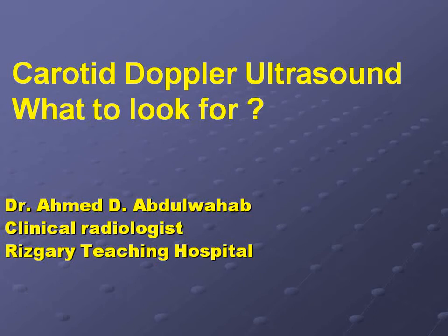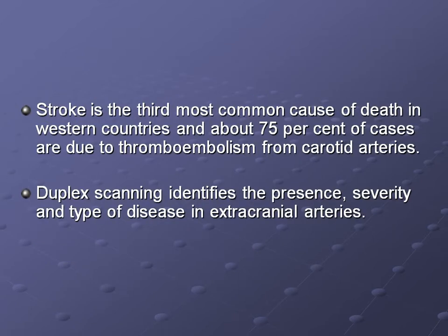Everyone. Today we are going to talk about carotid Doppler ultrasound and what to look for. First, we should know that stroke is the third most common cause of death in Western countries. About 75% of cases are due to thromboembolism from the carotid arteries. So that's the main indication of why we do carotid Doppler.